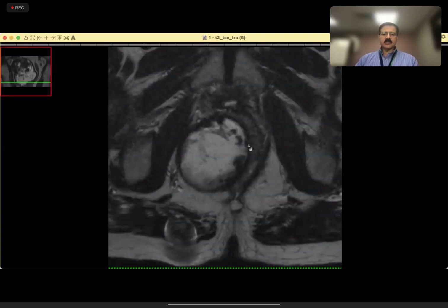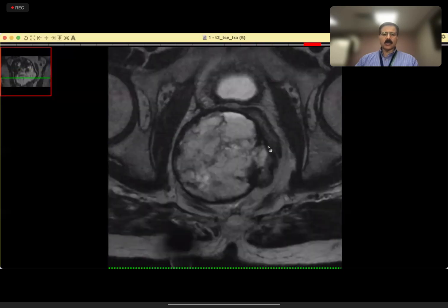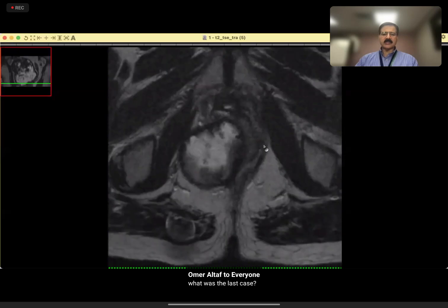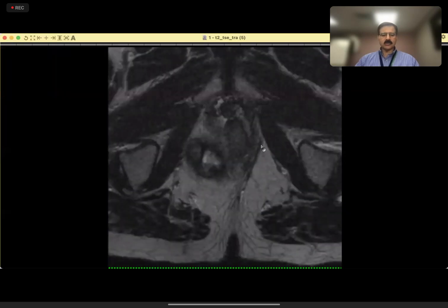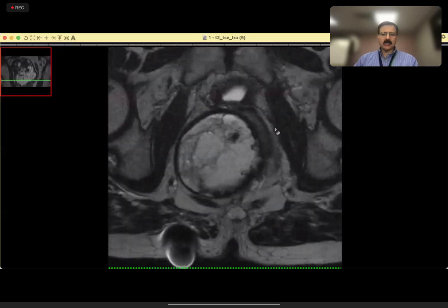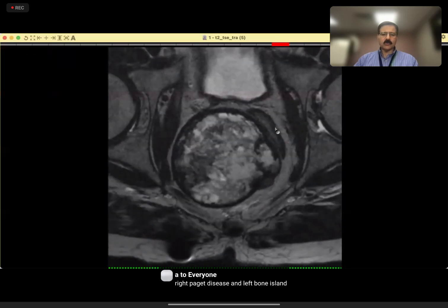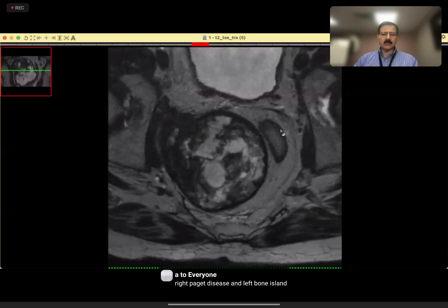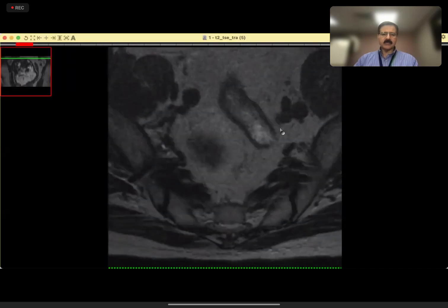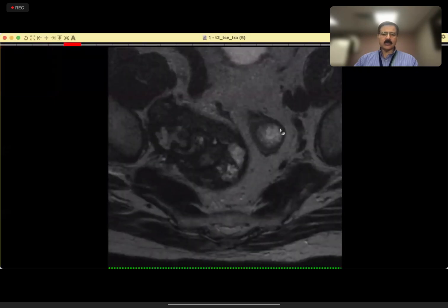This patient, candidate one, what happened was that the gastroenterologist were doing a colonoscopy, and they felt that there is something extraneous. These were the clinical notes, which was compressing the rectum, and they asked for an MR. Let me scroll up and down, and then you can give me your initial impression. So I've gone up. Now I'm coming down once again.